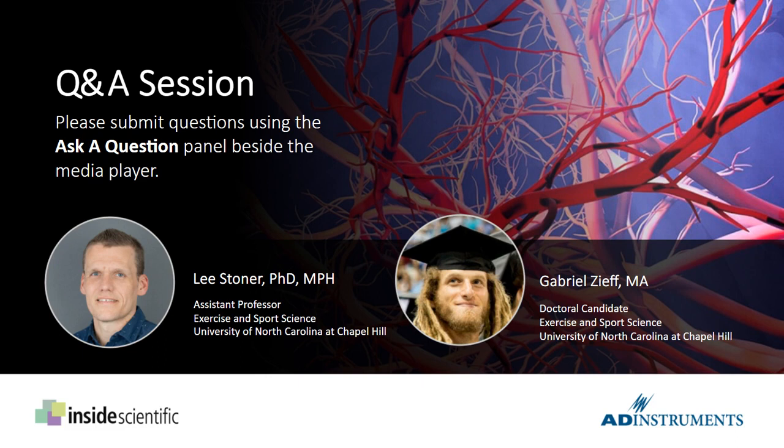So you can do that with the SphygmoCor, which is what we're using for a study right now. If you're using the Vicorder, because you're using oscillometry around the neck, there's, that sounds bad, but just there's a little balloon going around the neck to pick up the pulse, but it's being influenced by the vein, and you can get venous backflow, so you need to slightly tilt the body forward, and you can't do that if someone is laying down on their side.